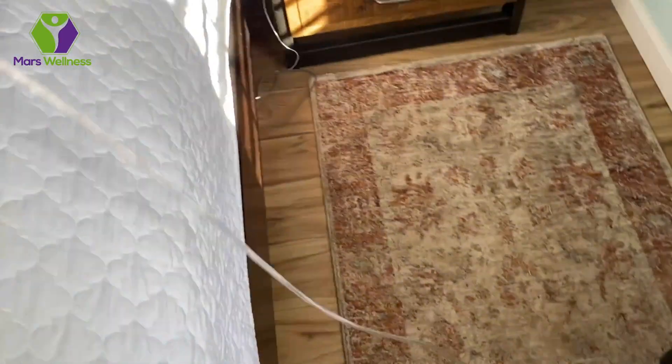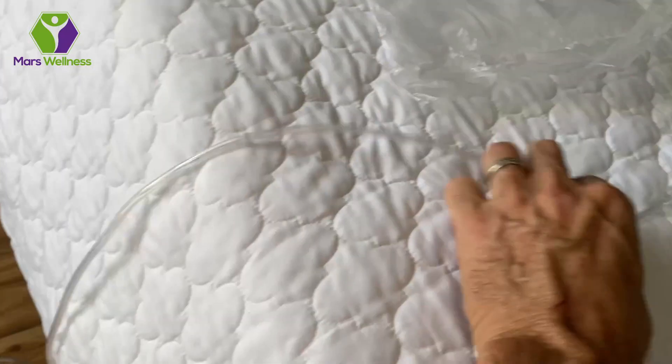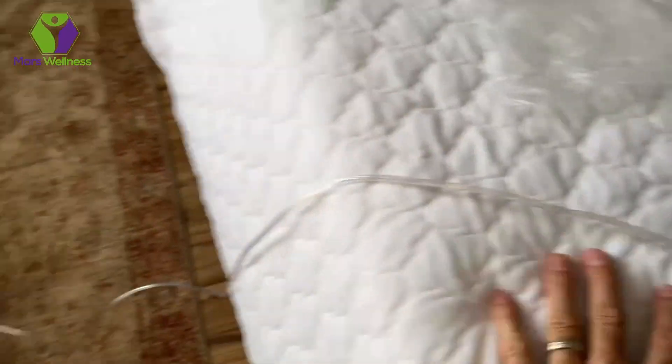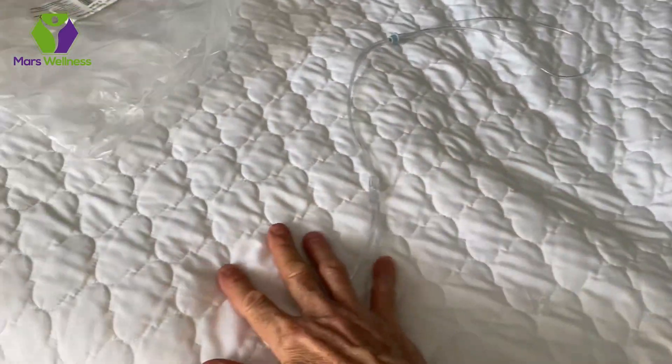Let me show you how this extends. It's not going to kink on you, but it's good to get all the little twists out. You can see it comes over from here and goes all the way to the other side of the bed, so it can be used on both sides, which is nice.